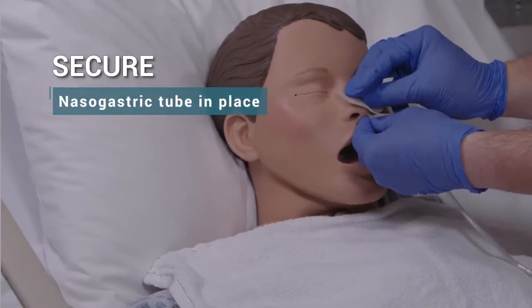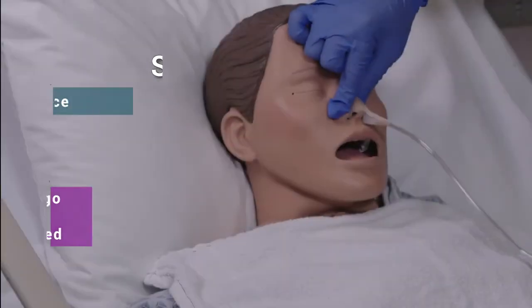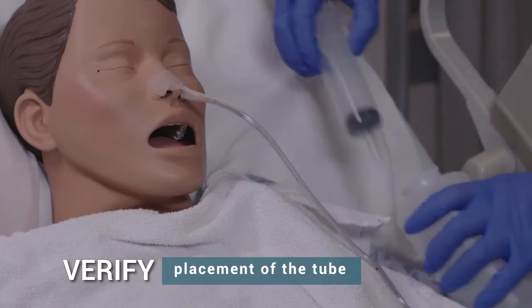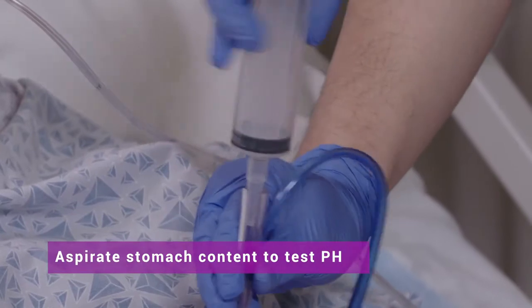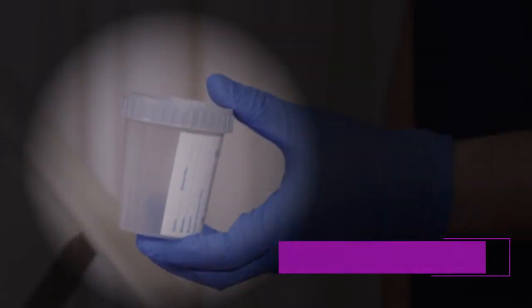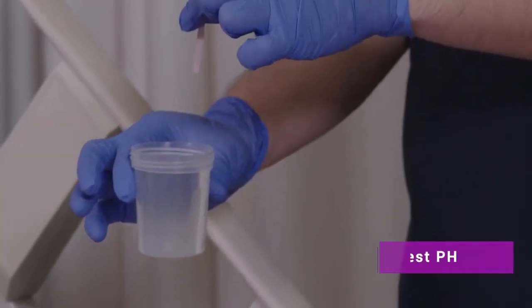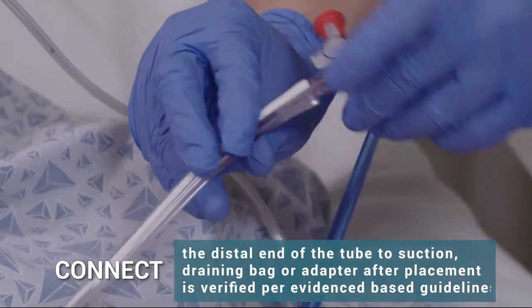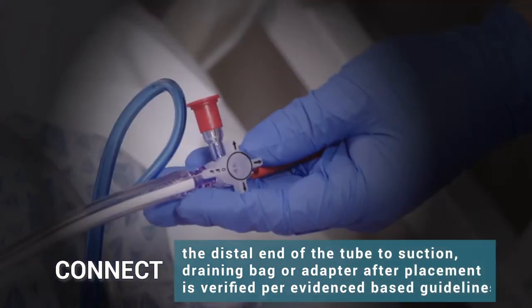Secure nasogastric tube in place — do not let go of the tube until secured. Verify placement of the tube. Aspirate stomach content to test pH, collect gastric content, and test pH. Connect the distal end of the tube to suction, draining bag, or adapter after placement is verified per evidence-based guidelines.